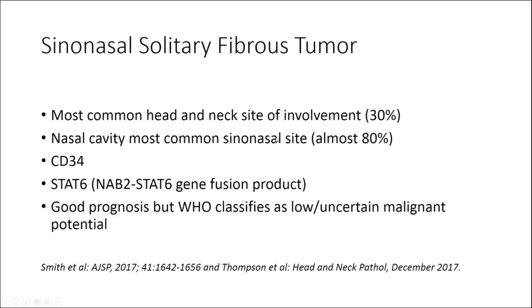About 30% of solitary fibrous tumors are identified in the head and neck, and the nasal cavity is one of those common areas. Most of those occurring in the sinonasal tract are usually seen in the nasal cavity. They express the marker STAT6, through the gene fusion of NAB2 with STAT6, resulting in the STAT6 protein.